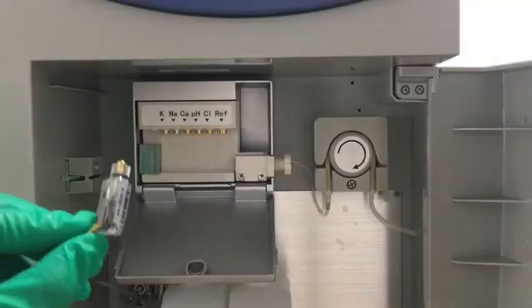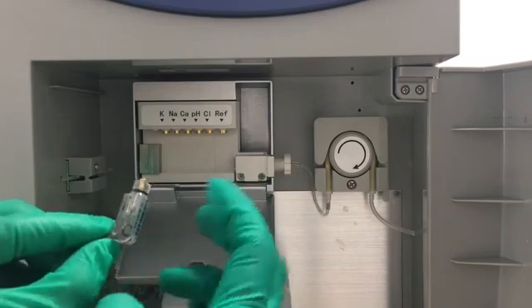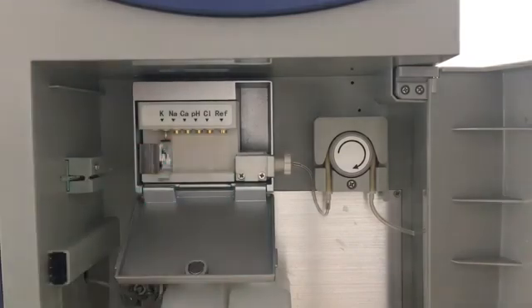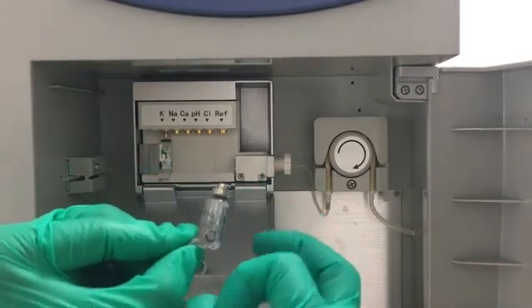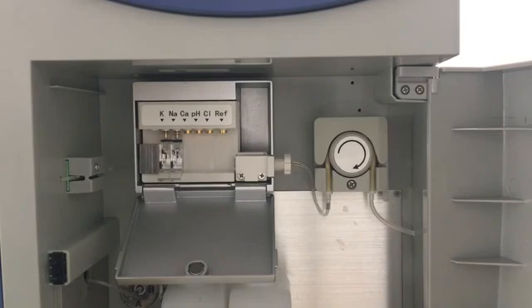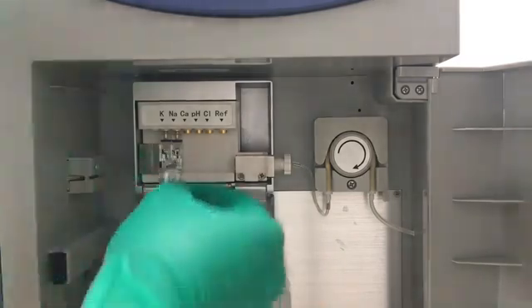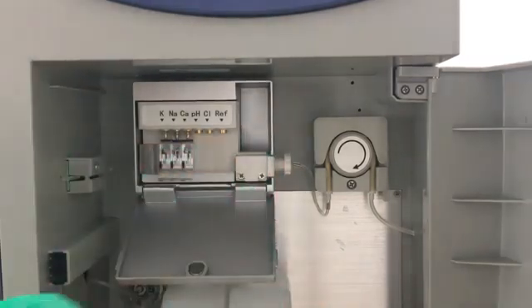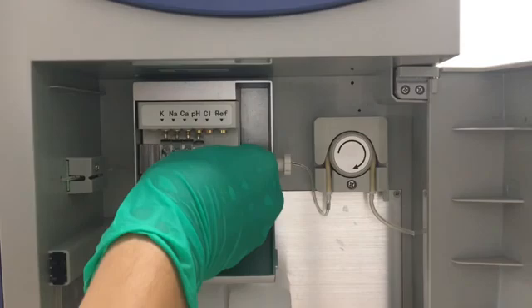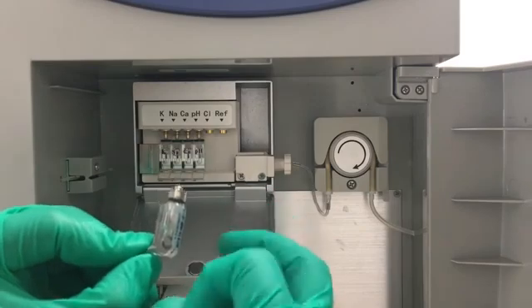Now we install the electrodes. We hold the electrode and use our finger to flip the bottom of each electrode. They should be installed according to the sequence marked above. Since every movement or trembling can introduce bubbles, we have to remove bubbles before every electrode installation.